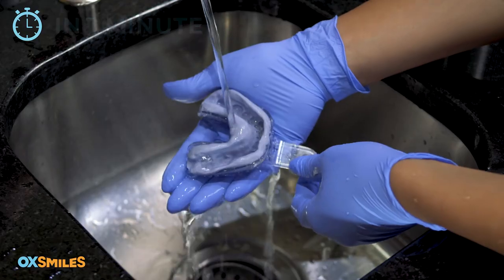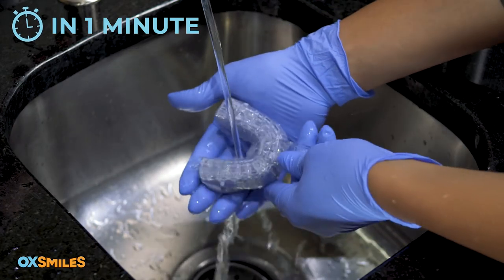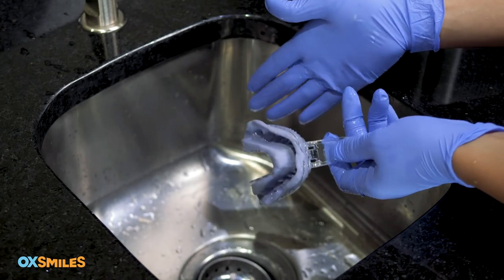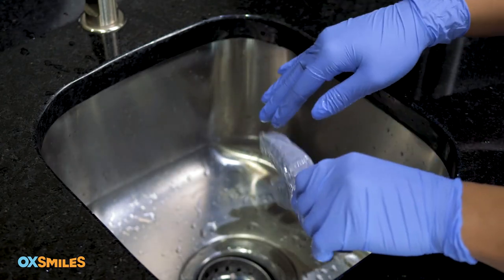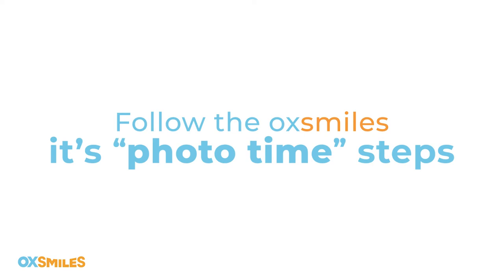Once you've completed all four impressions, you'll need to clean them by running cold water over each one individually for a minute. Allow the excess water to gently drip off before placing them into the labeled bags included with your kit.